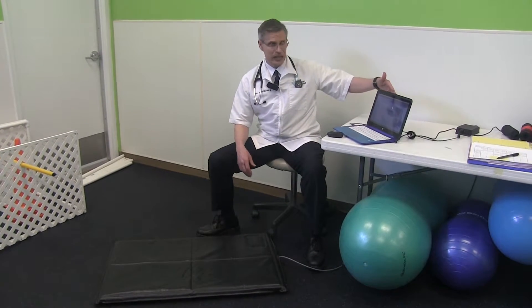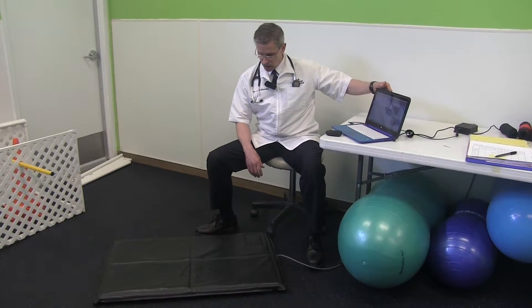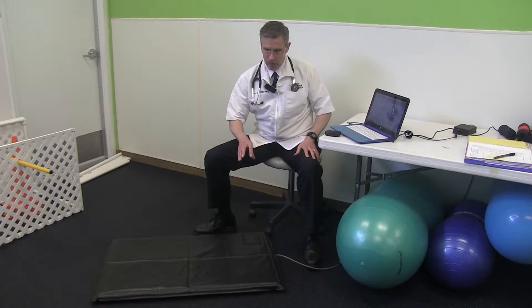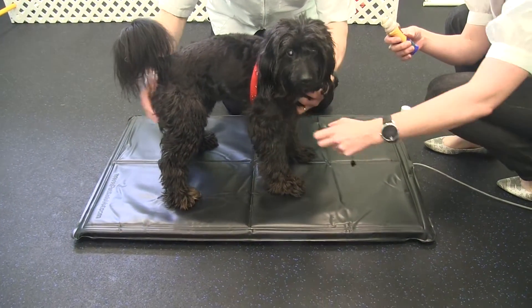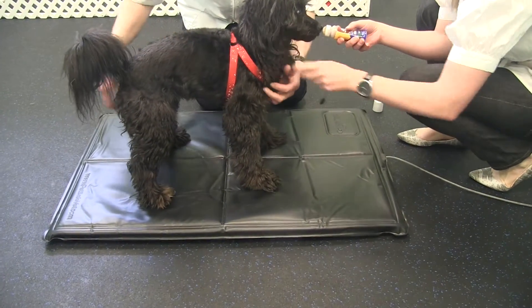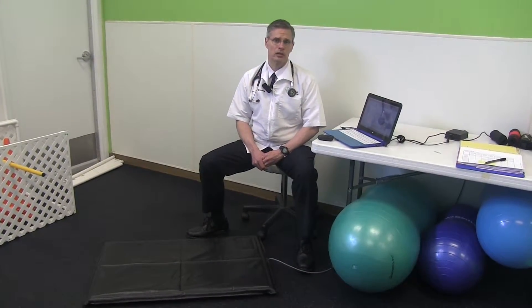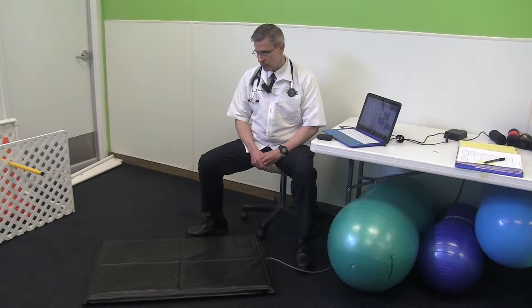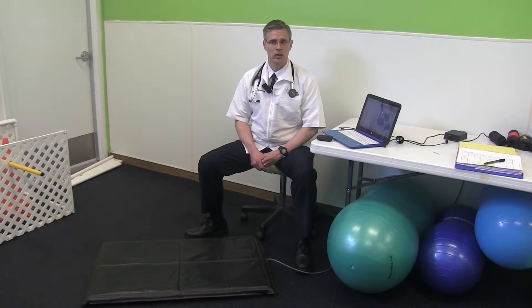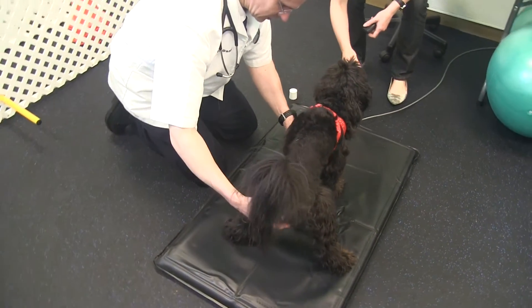It gives us the ability to get some actual data on how much weight they're putting on each limb. It does allow us to diagnose, validate, and document what leg they are unweighting, so it does help in the diagnosis of lamenesses.